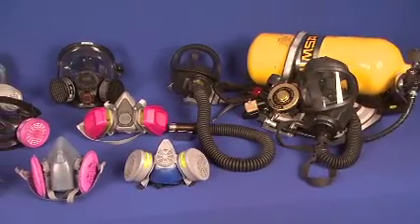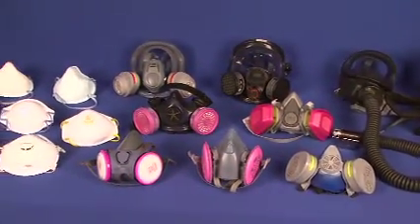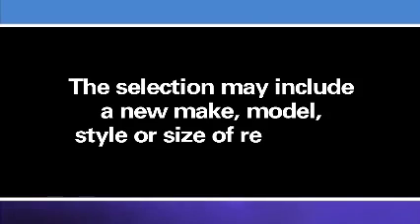If you find that the fit of your respirator becomes unacceptable, you must be allowed to select a different type of respirator and be retested. The selection may include a new make, model, style, or size of respirator.